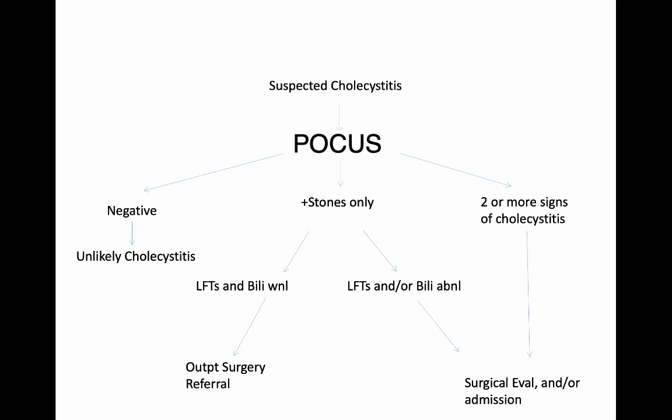And then just again, touching on pancreatitis, use point of care ultrasound to quickly rule in or out whether it looks like gallstone pancreatitis or not. Take a look at the common bile duct to see if you think it looks dilated. Look at the pancreas. I know sometimes you think the pancreas is difficult, but just scan, even if you can't find the pancreas itself, scan in the area of the pancreas, make sure there's not some giant mass or huge pseudocyst. And then those patients can generally go on to follow up with MRCP imaging, and most of the time a CT scan doesn't really add much to their workup.